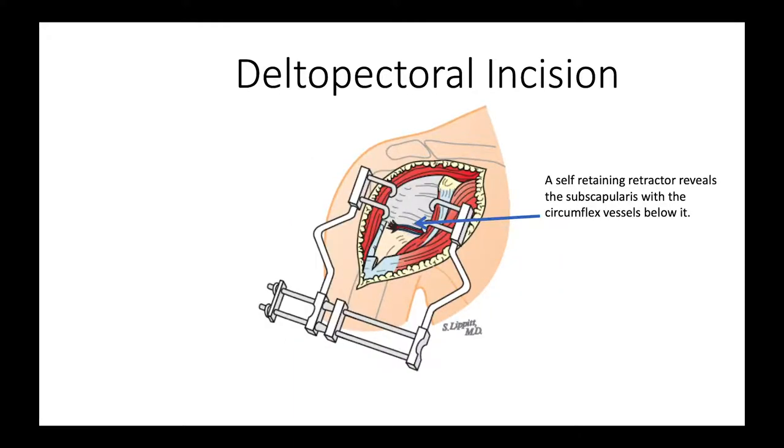We put a self-retaining retractor in, and that enables us to see the subscapularis here and the anterior circumflex vessels there.